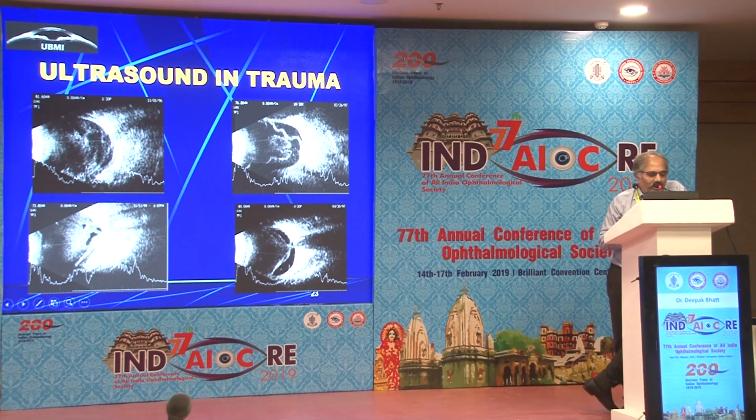This is a scenario where I thought that there is a vitreous hemorrhage, and this probably was, according to me, an initial diagnosis of a retinal detachment with subretinal hemorrhage. And this patient came after 10-15 days. The entire vitreous hemorrhage has got absorbed, with a thick PVD attached to the disc. The suspected retinal detachment has disappeared. So situations can mimic differently in the initial stage of trauma. Over a period of time, the situation will change. So one needs to repeat an ultrasound. If he has no view of the fundus, you need to repeat an ultrasound just prior to any second surgery that you plan to do in trauma.